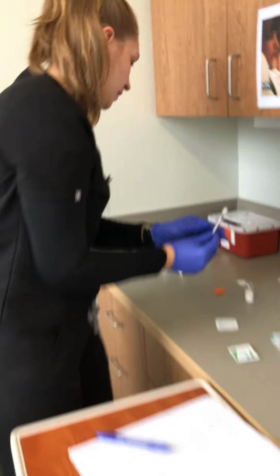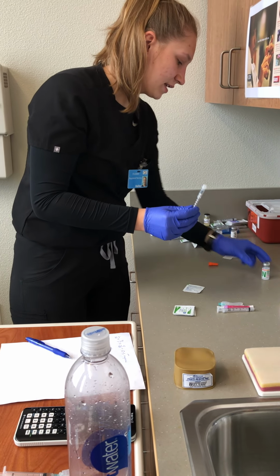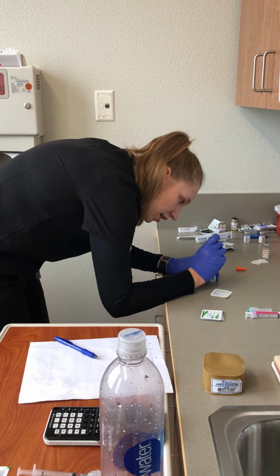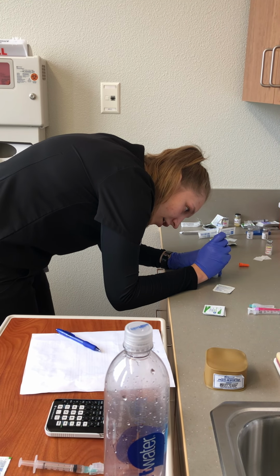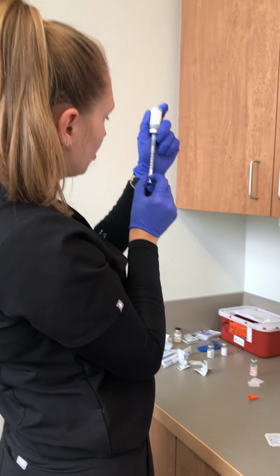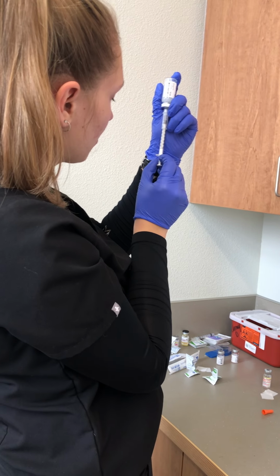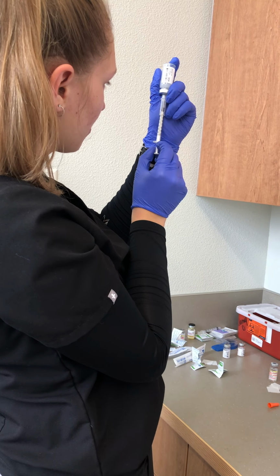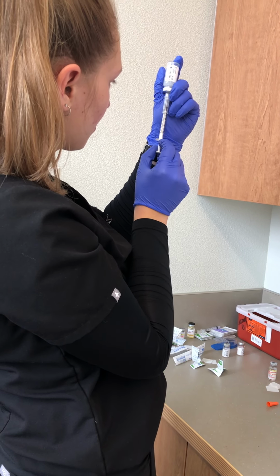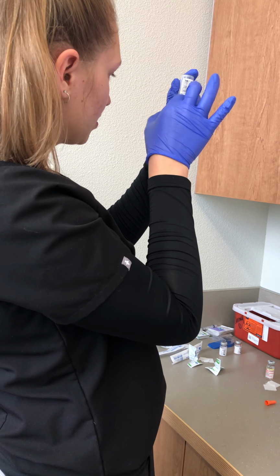Okay. So now I'm going to move this off to the side, and now I'm going to pull up 16 units of my NPH, but I cannot pull past that or else I'd have to start over. So I'm going to pull back to the 25. There. Sure there's no air bubbles.